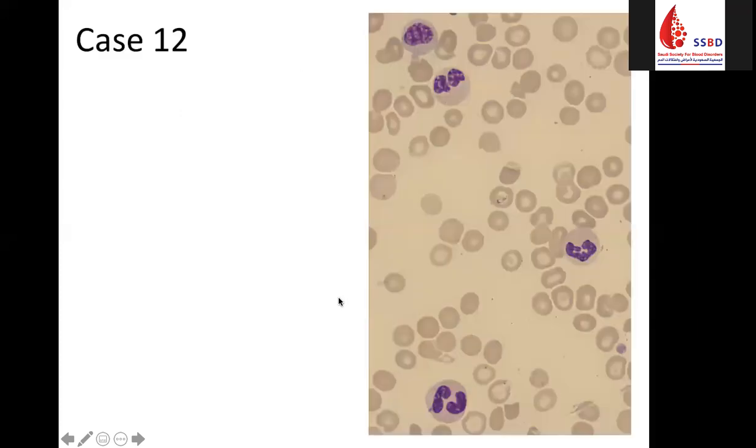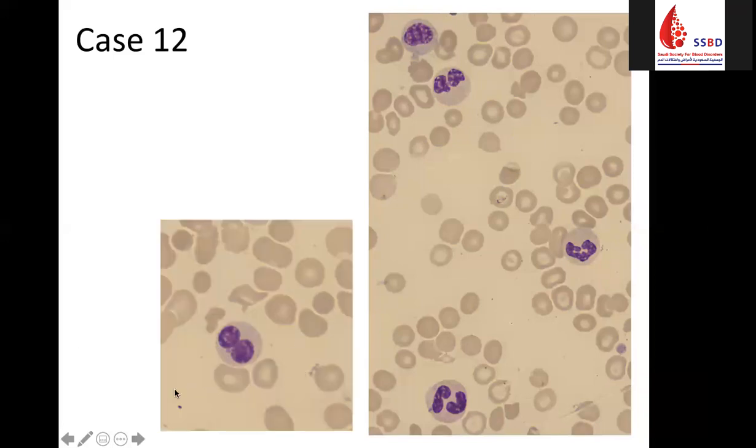And this is your finding. So in the previous case, we had a leukocytosis, which may disrupt your finding. But in this case, I think it is going to be very clear for you. So we have neutrophils that are bilobed, and we have a separated lobe in the neutrophil. You have a band, and you can see that we have a thrombocytopenia. This is also bilobed, although we don't see the thread connection, but mostly a bilobed or abnormally lobulated neutrophil.